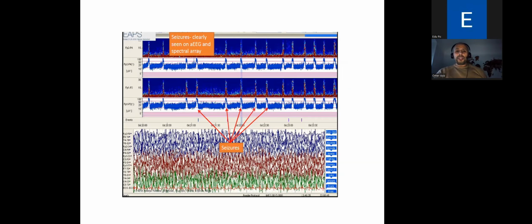Again, this is a demonstration of someone who's having regular seizures. So those sharp inflection points are indicative of electrical seizures. And then you need to make a clinical decision. Are those significant? Do you want to treat them?